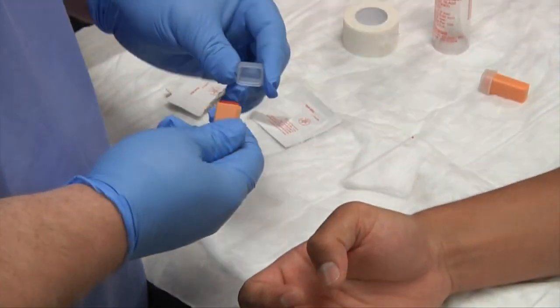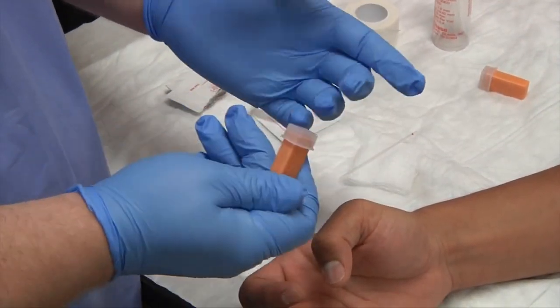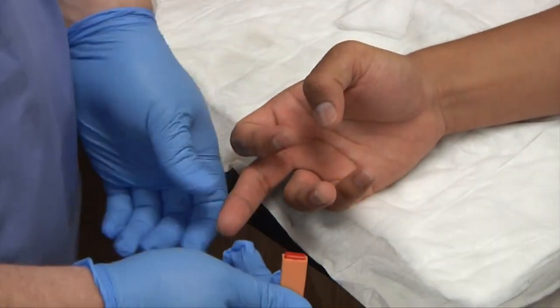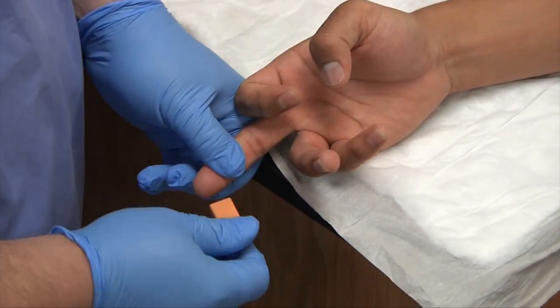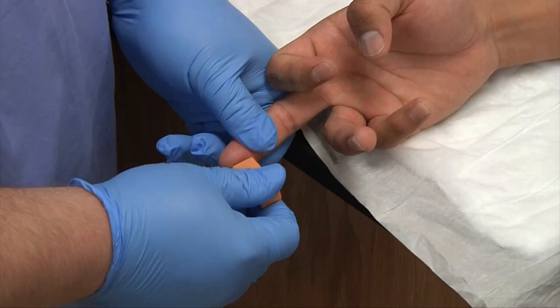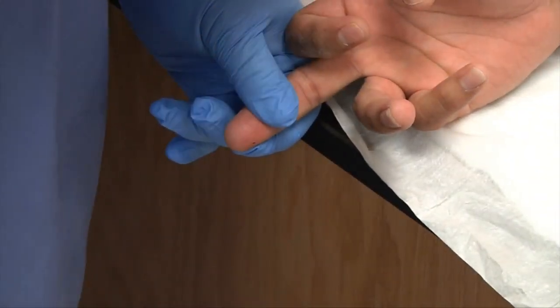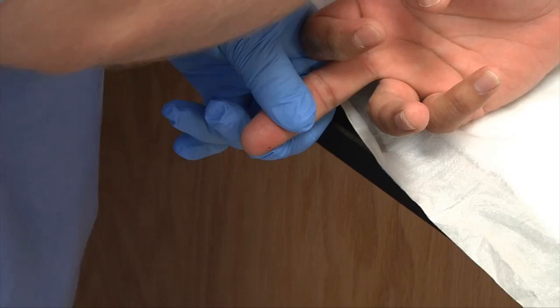The alcohol is dry now. I have my lancet — it's already preloaded. Take off the cap. Squeeze the patient's finger, put the lancet up to the finger, and push in. You'll hear it click, which means the lancet has punctured the finger.